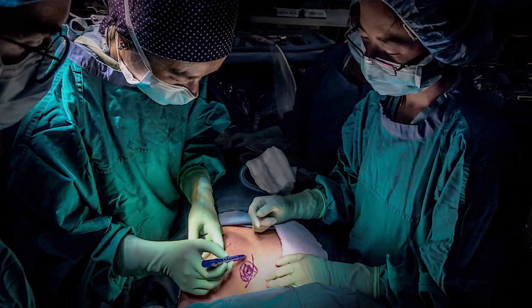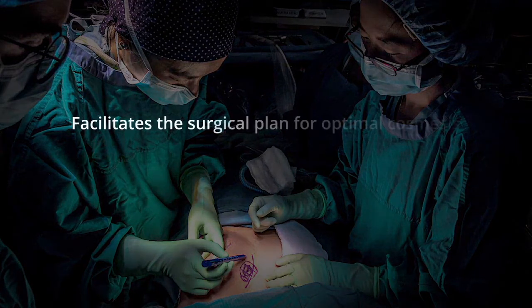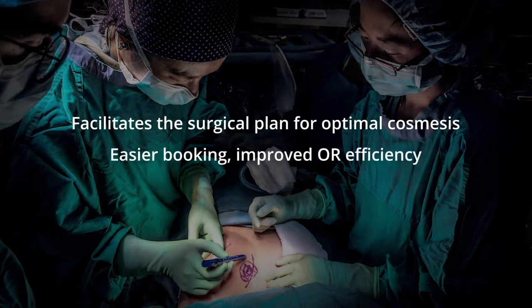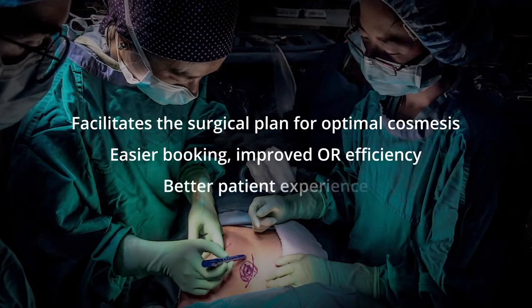Decoupling radiology and surgery facilitates a surgical plan for optimal cosmesis, provides easier booking, improved OR efficiency, and a better overall patient experience.